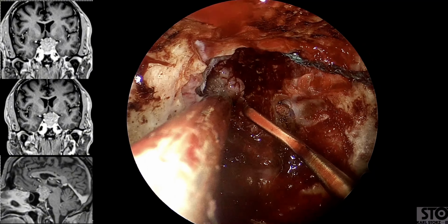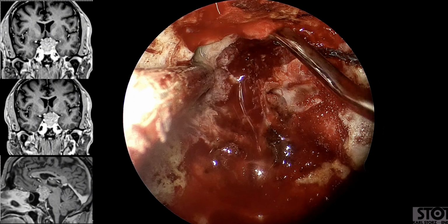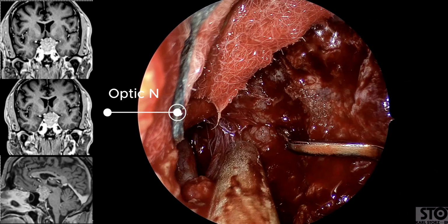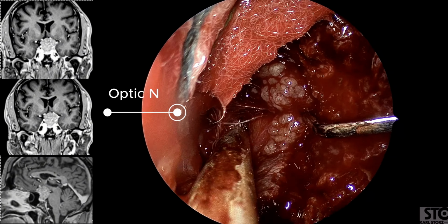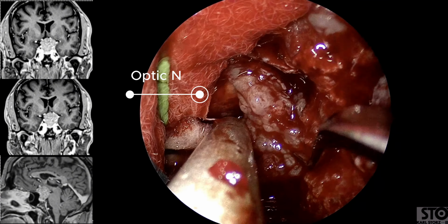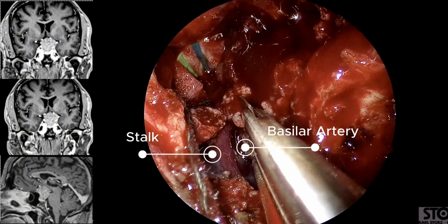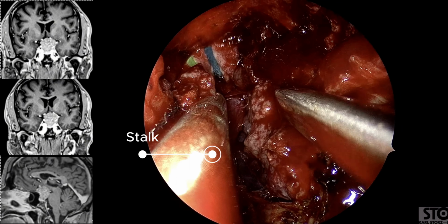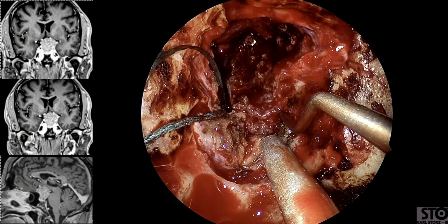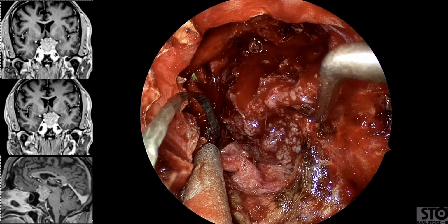After reducing the tumor volume, we use an Angelina number 1 to continue dissection of the lateral margin of the tumor and separate the tumor from the right optic nerve. As we proceed downward, we divide the dural attachment from the diaphragm with internal debulking and gentle elevation of the tumor and separation from key structures that become visible, including the pituitary stalk and the basilar artery. Using a number 4 Angelina dissector, we continue towards the left side along the inferior aspect of the tumor.